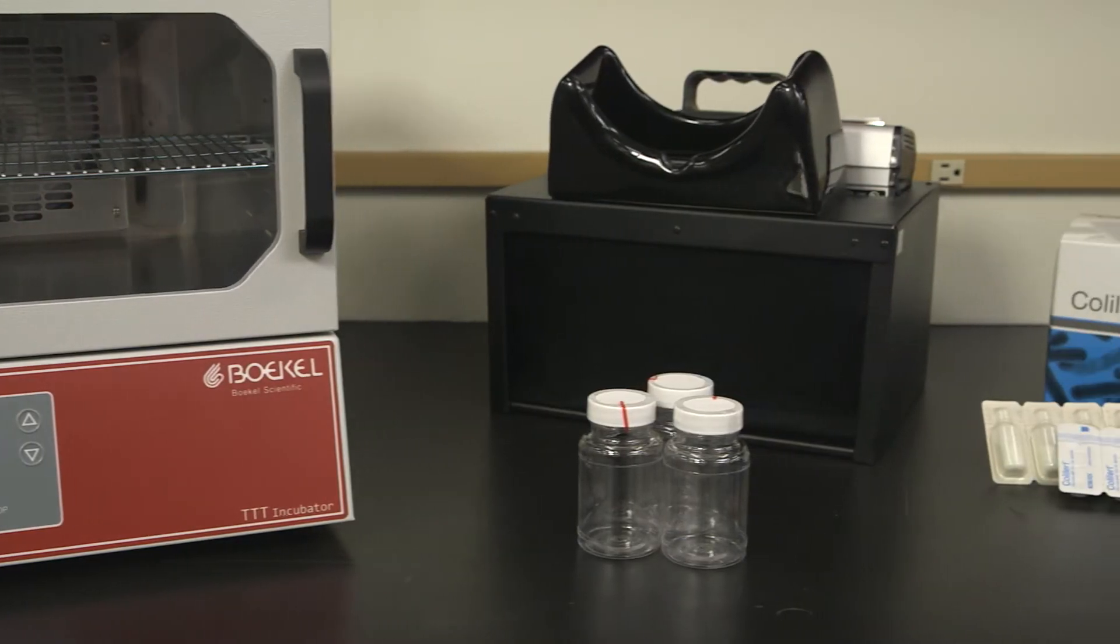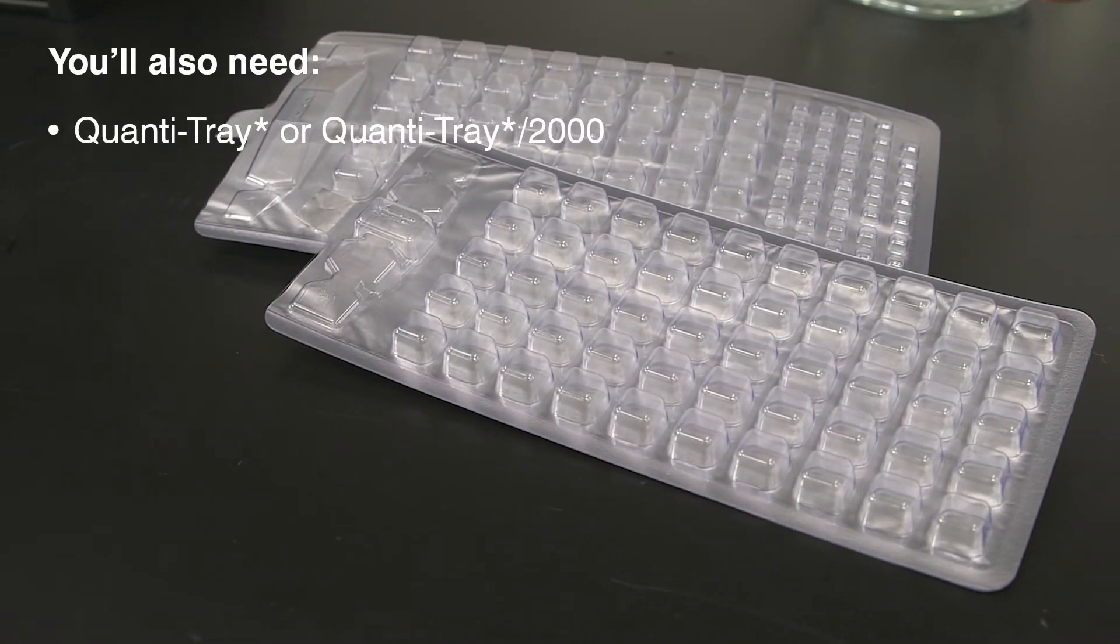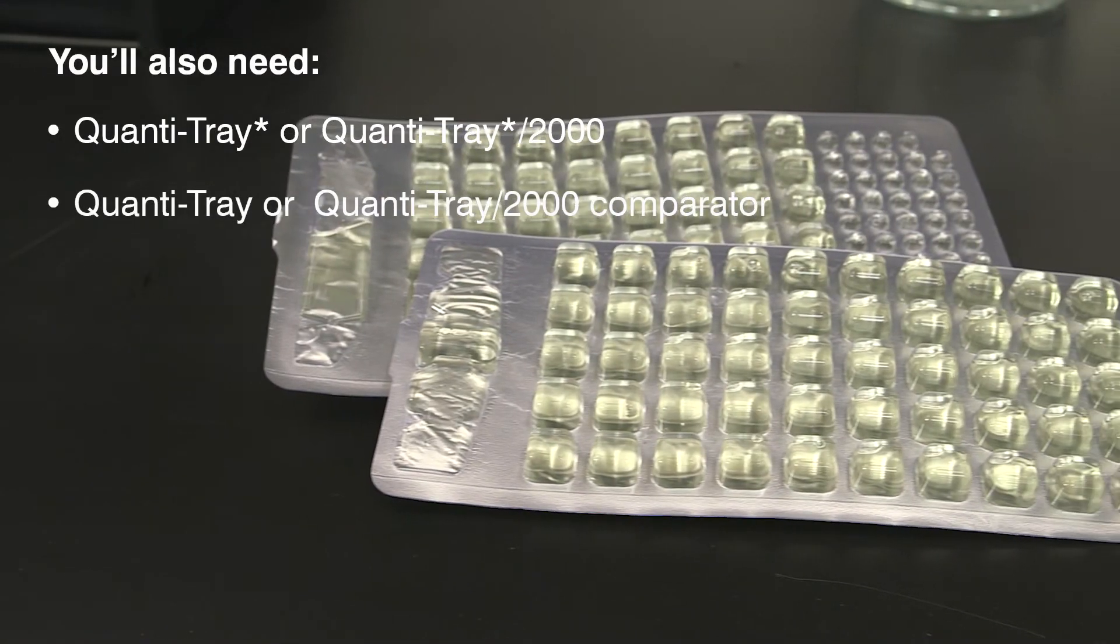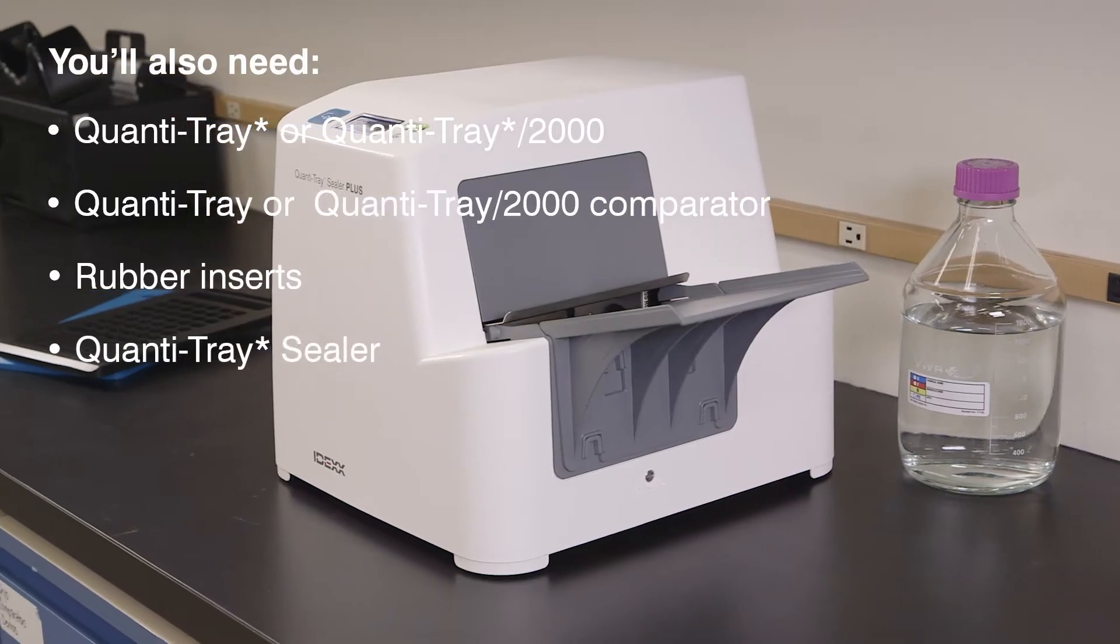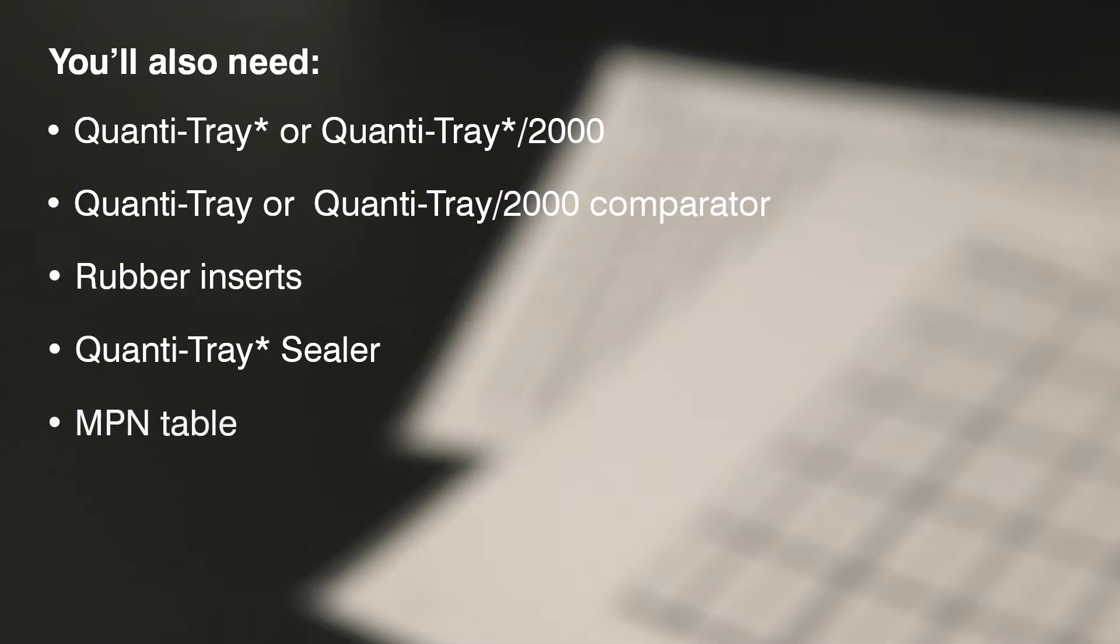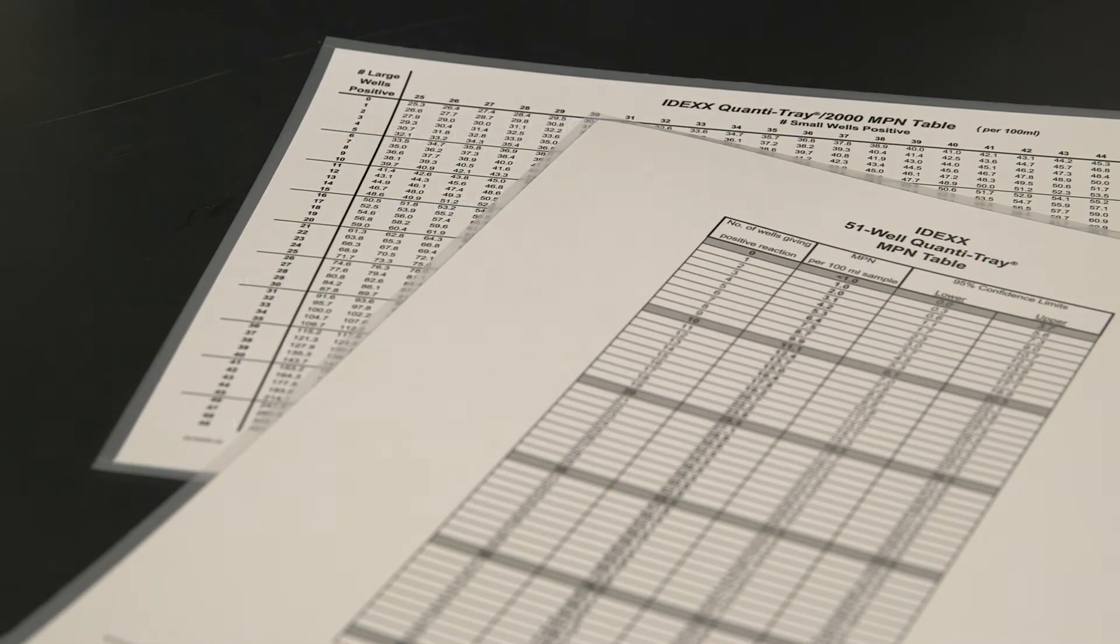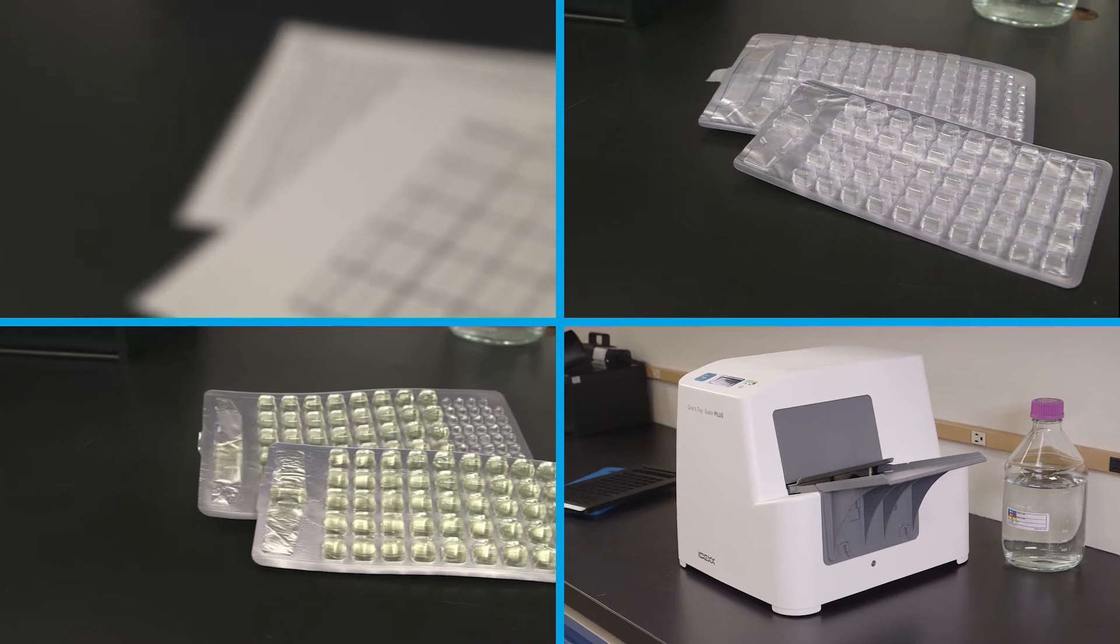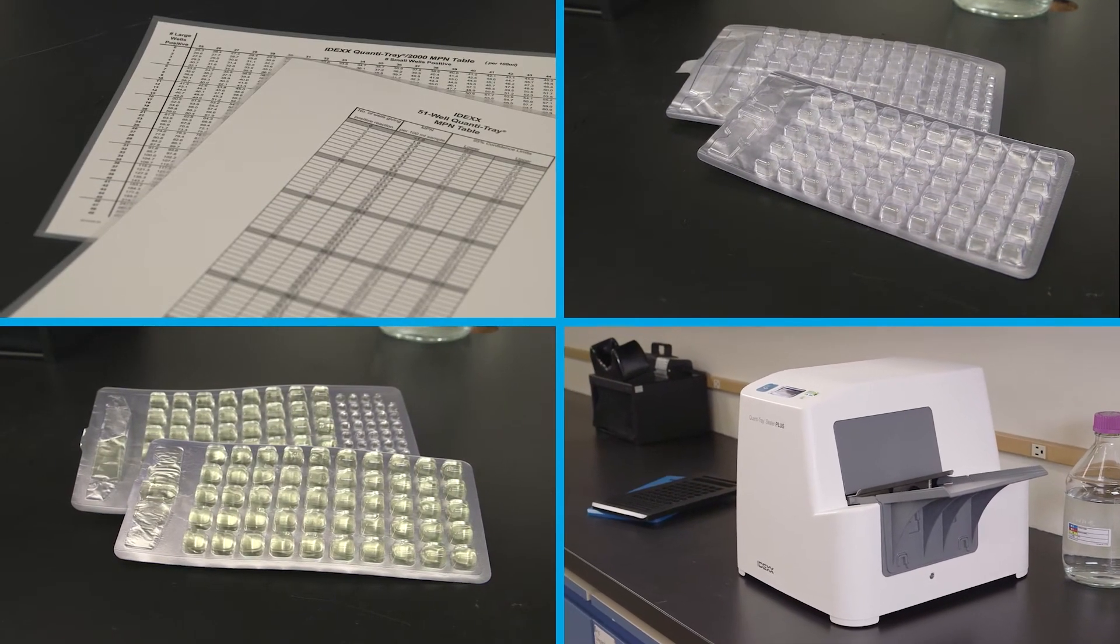In addition to the materials used for presence-absence detection for quantification, you will need a Quantitray or Quantitray 2000, a Quantitray comparator, Quantitray rubber inserts, a Quantitray sealer and the included Most Probable Number Table or the IDEXX Automated MPN Generator Program found at IDEXX.com. All of these items are included in the Quantitray system and are available from IDEXX.